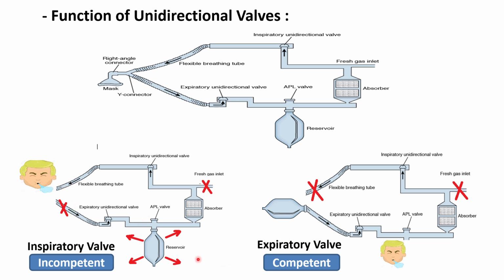If this bag or reservoir gets inflated, this valve is incompetent. If it does not get inflated, this valve is fine and working.